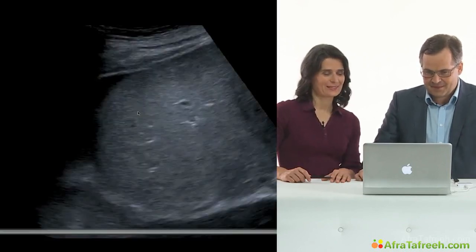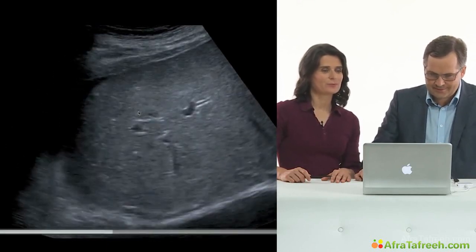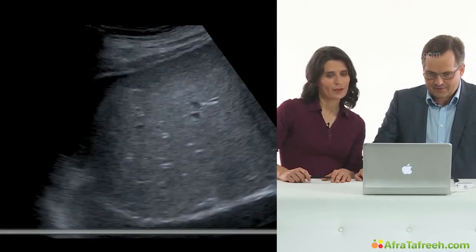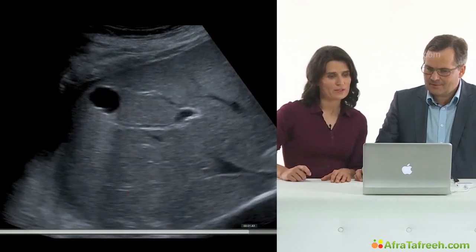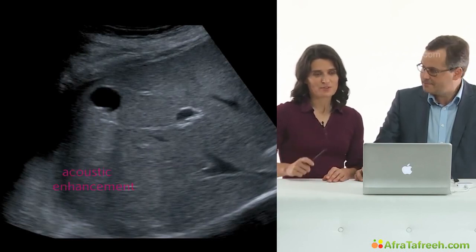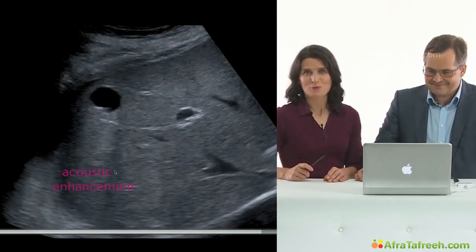In this clip, is there a cyst too? Yes, it's a liver cyst. It's very easy to detect. In this case, the enhancement of the ultrasound beam is displayed even more easily because we've got the homogeneous parenchyma of the liver surrounding the structure. Remember this video clip? It contains even another ultrasound artifact to which we will refer later on.